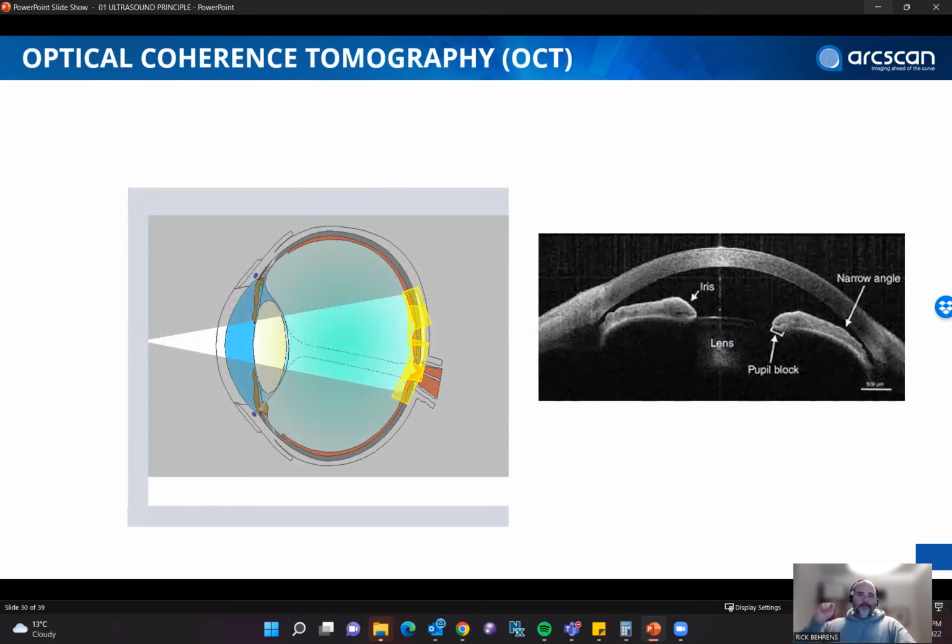We are constantly fighting against our friends, the OCT. The reason is the doctor will tell you, oh, but this is a better image. You can see that this is perfectly fine. This is a really, really good image. But what happened here, we don't know. So the OCT does not tell you the whole story of what's happening behind the iris.